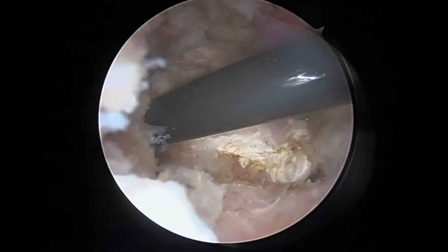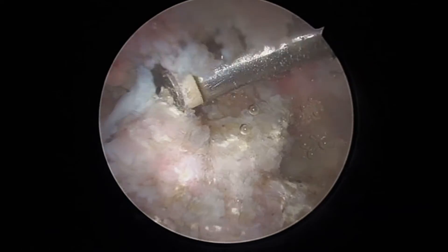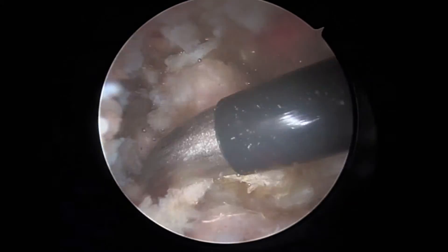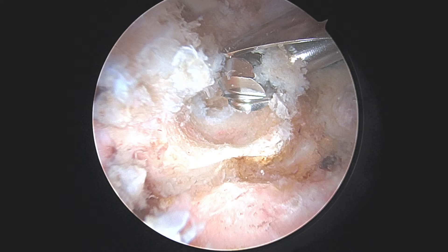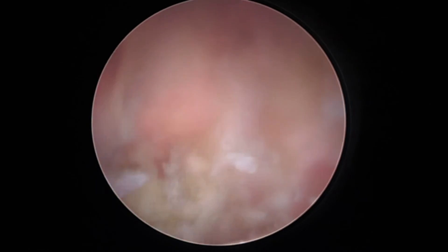Once the HO was identified arthroscopically, an Arthrox Apollo H50 probe was used to expose the HO and dissect the soft tissues. A burr was then used to debulk the HO, and then a grasper was used to remove the HO from the soft tissues.